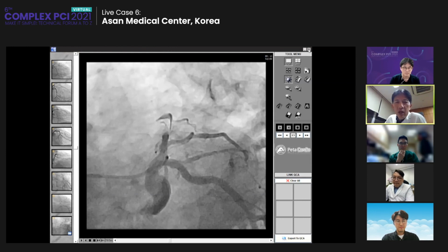And so even for the antegrade approach, we can see the distal vessel image. So that is the reason why maybe something like a small channel connected to the distal. Yes. So we have a chance for the antegrade approach, of course, at first.